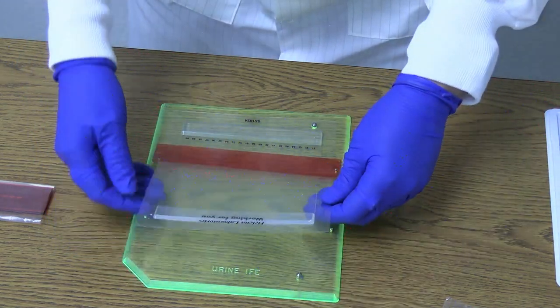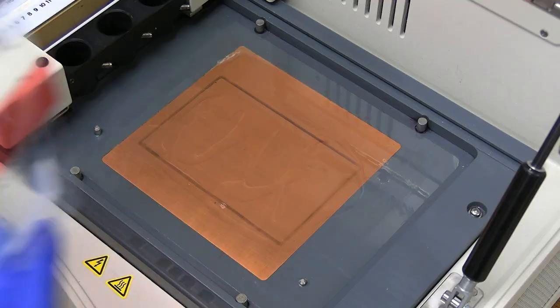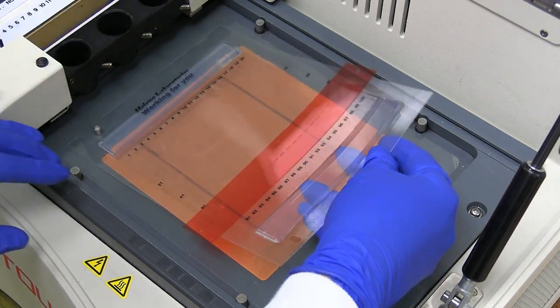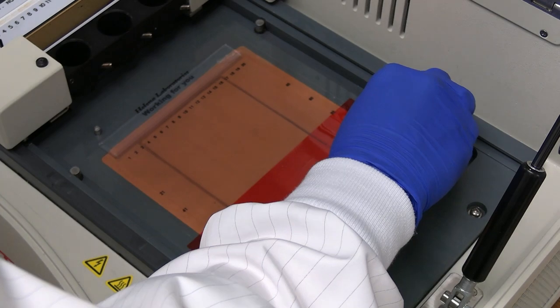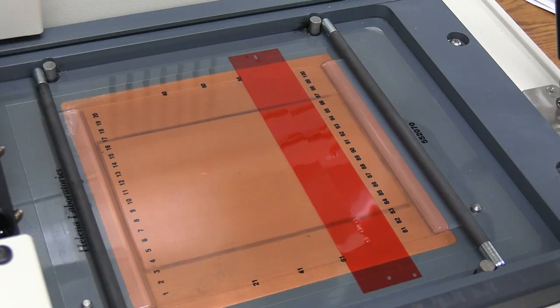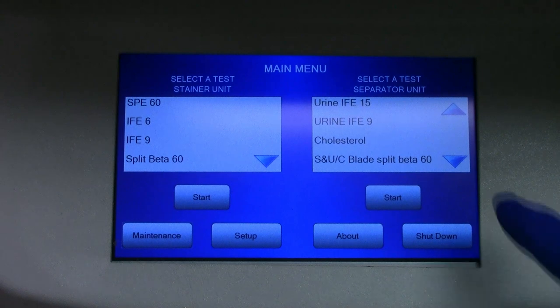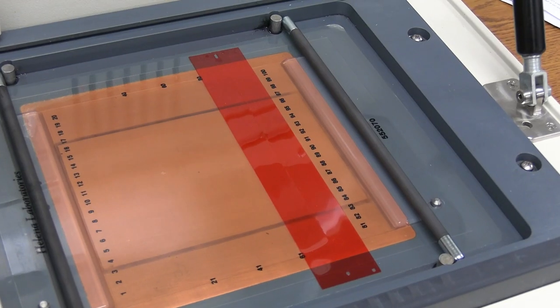Gently remove the gel with the placed templates from the SPIFE urine alignment guide and place the gel correctly onto the electrophoresis chamber. Wipe around the edges of the plastic gel backing, especially next to the electrode posts, to remove excess prep. Clean the electrodes with deionized water and wipe with a lint-free tissue. Place a carbon electrode on the outside ledge of each gel block outside the magnetic posts. And use the arrows under the separator unit to select the appropriate test and press start.